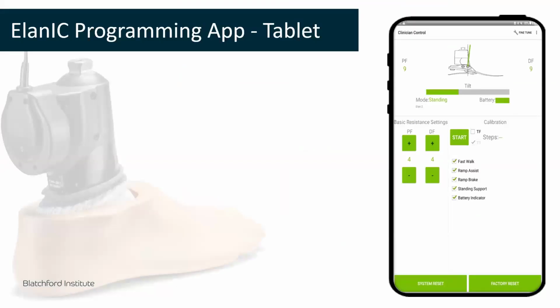Now the Elan can be programmed with an Android tablet or phone, or still the PC. I haven't used the PC programming in quite a while because the tablet is just so simple. Everything is on that one screen, very easy to connect with the tablet, and then go through the programming. You can program one of these in less than 30 seconds, if the alignment is correct, and then it's very fast and simple to calibrate and program.